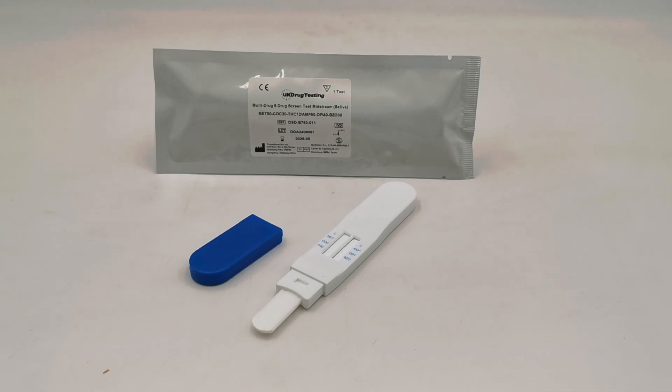This screen tests for methamphetamine, cocaine, cannabis, amphetamine, opiates, and benzodiazepines.